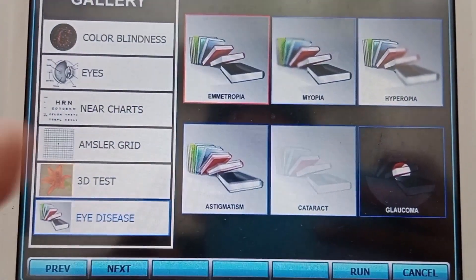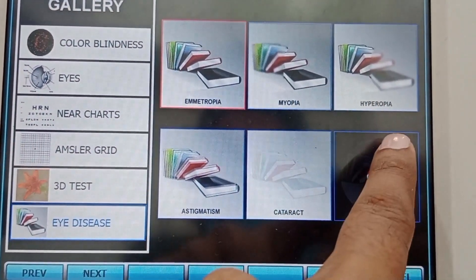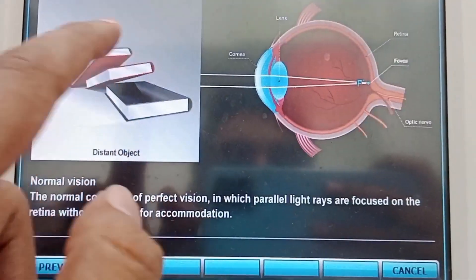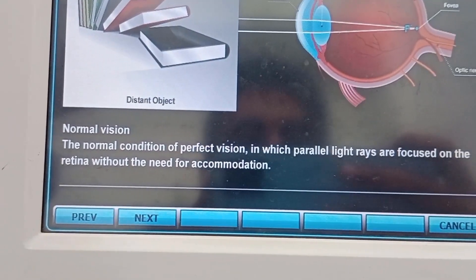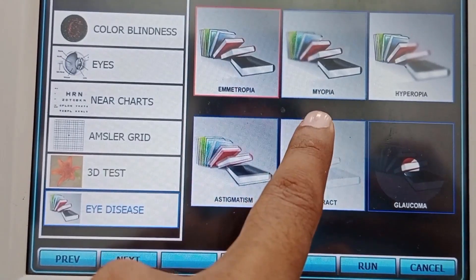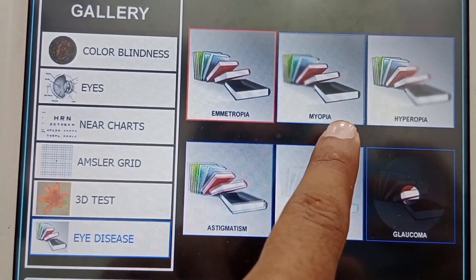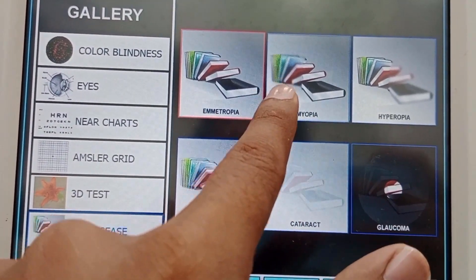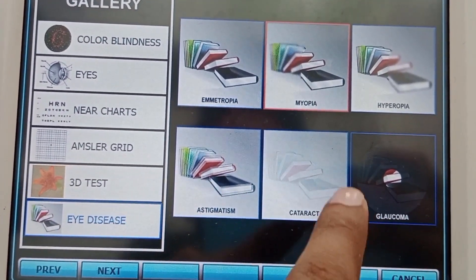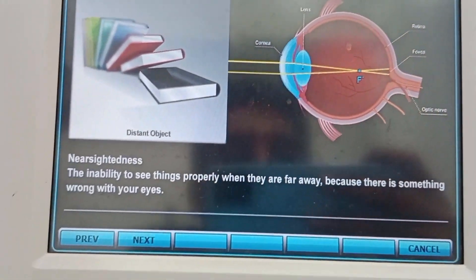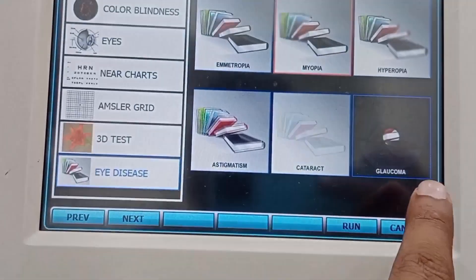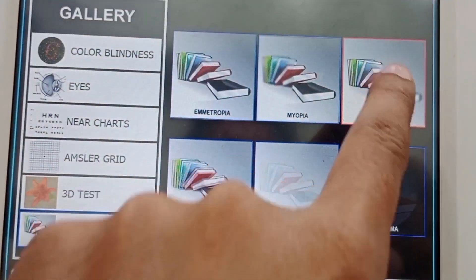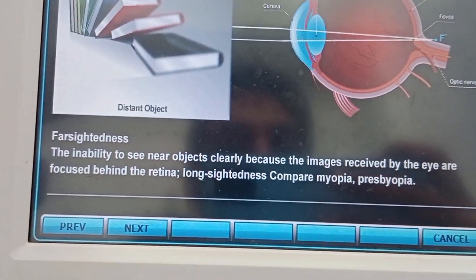The next section is eye diseases, with different definitions of emmetropia, myopia, hypermetropia, astigmatism, cataract, and glaucoma. If I click on emmetropia or normal vision you can see the definition. For myopia, the distance is blurred and near is clear. In hypermetropia, near vision is blurred and distance vision is clear — the definition of farsightedness.